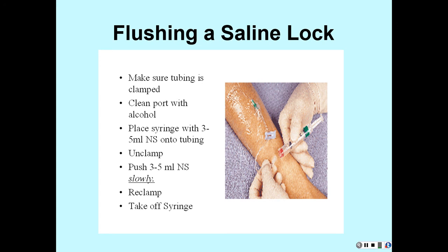So we flush them routinely or before and after any medication. You do want to flush between medications as well.